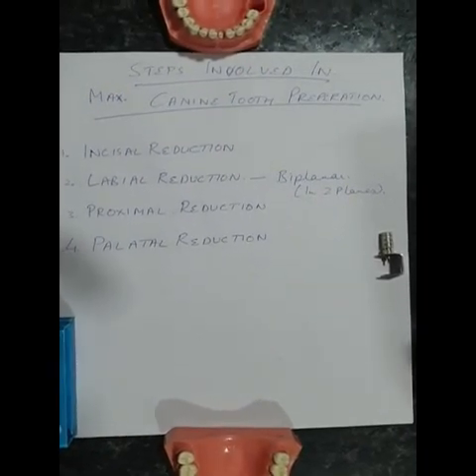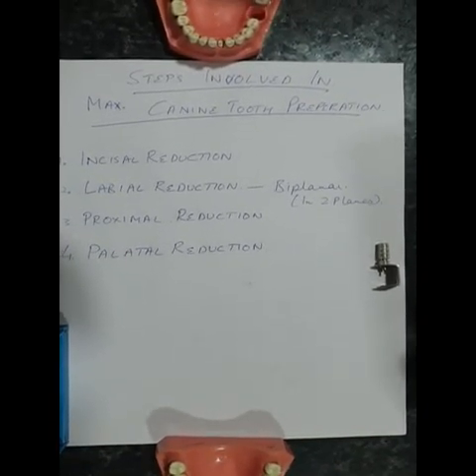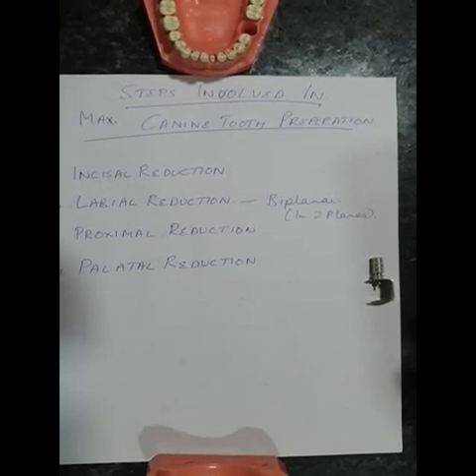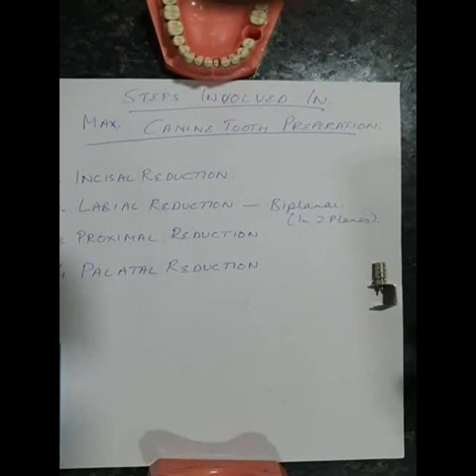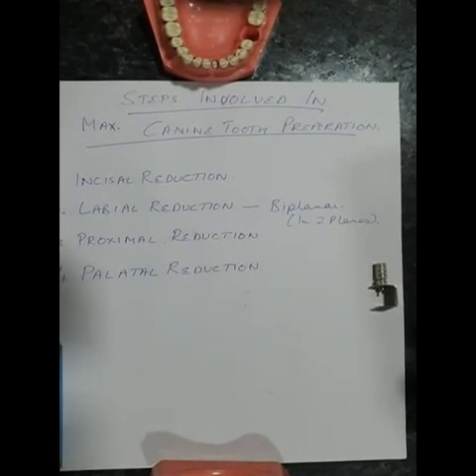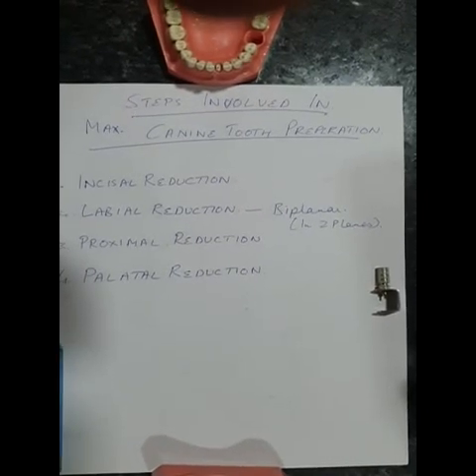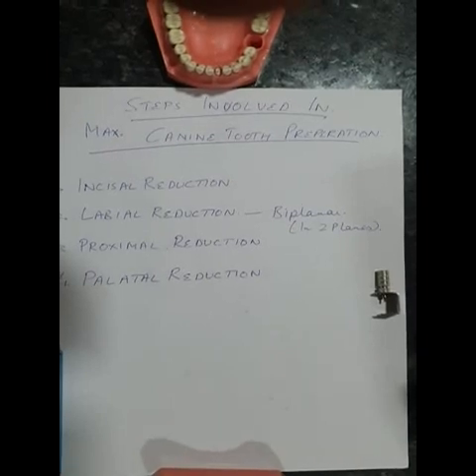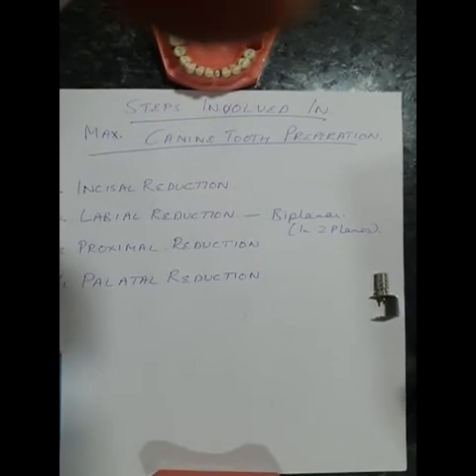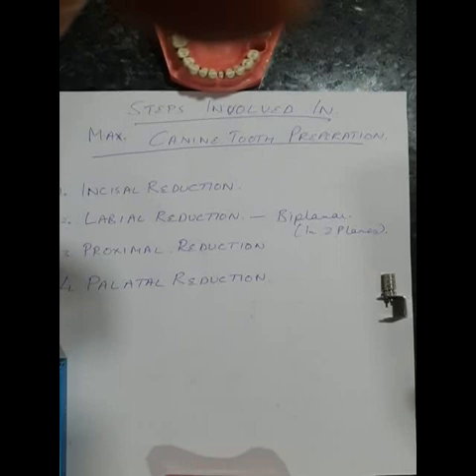In this biplanar reduction, we divide the labial surface into two halves: one is the incisal two-third and another is the cervical one-third. First, we draw imaginary lines on the labial surface, divide it into three equal parts, then place our bur at the tip of the lower border of the middle third — the area above that becomes the incisal two-third. We then give depth orientation grooves in the incisal two-third area at a slight angulation of around 20 degrees to the long axis of the tooth.